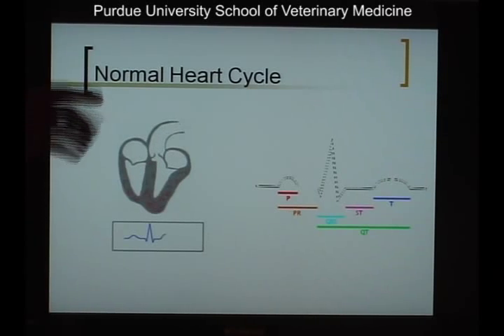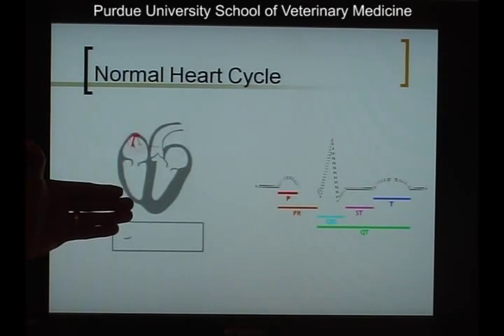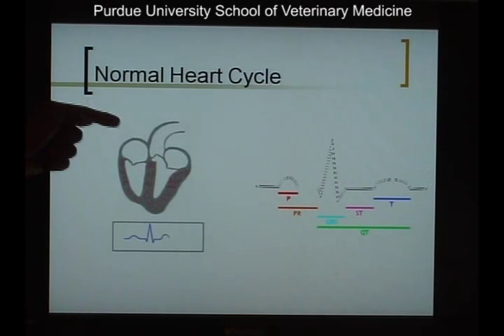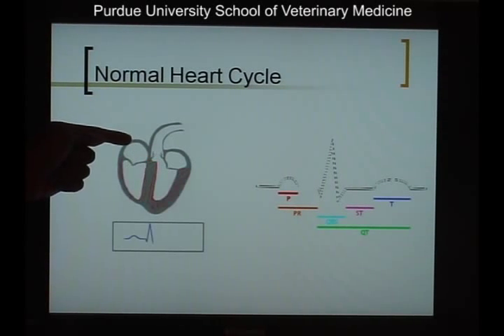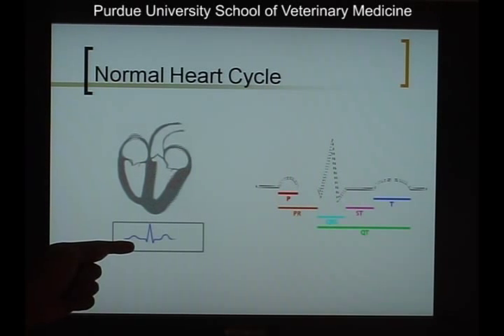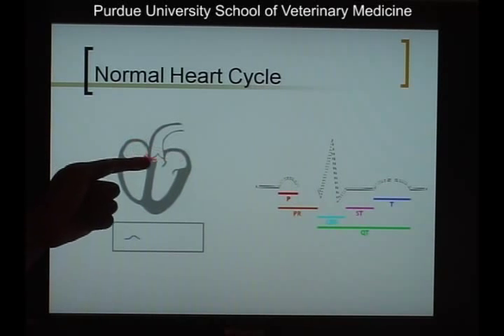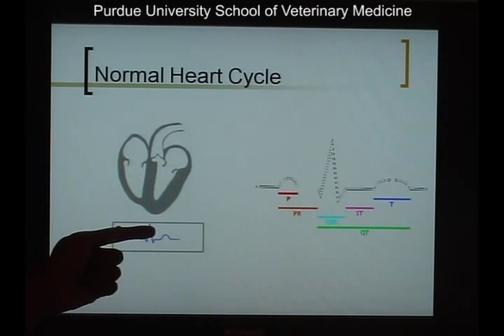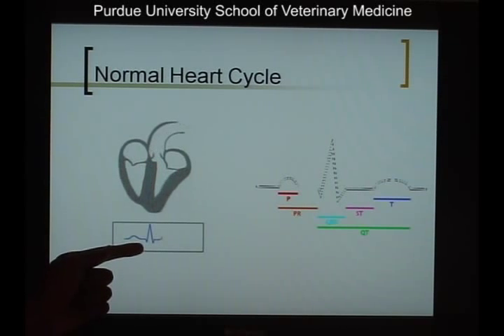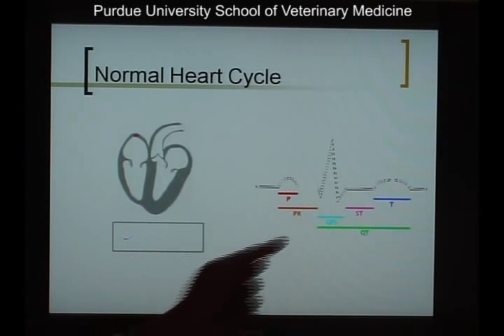In a normal heart, you have chambers that sit up top called the atria and chambers that sit at the bottom called the ventricles. When an electrical stimulus causes the atrial muscles to contract, it creates a waveform known as the P wave, which is seen here and here. When the ventricles start to get stimulated by this electrical activity, it creates a waveform called the QRS complex, which you can see here and here.